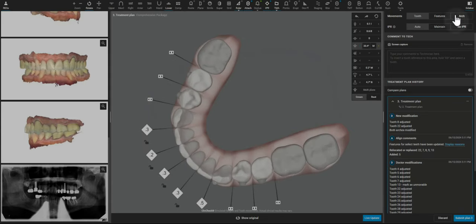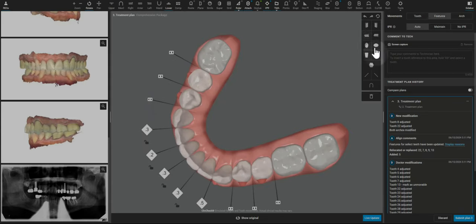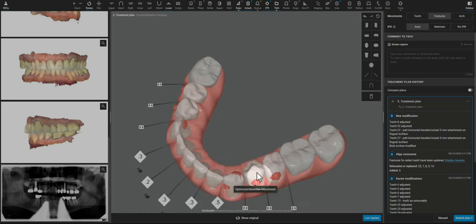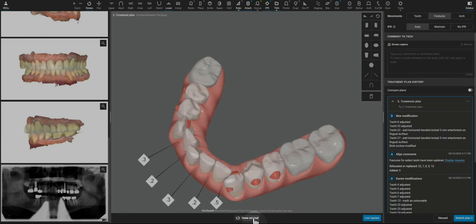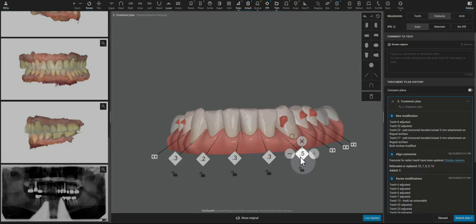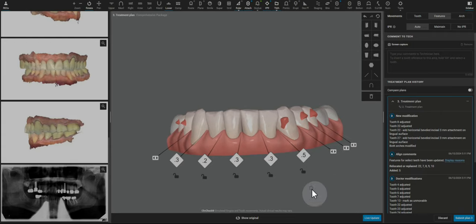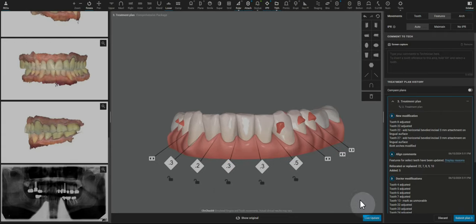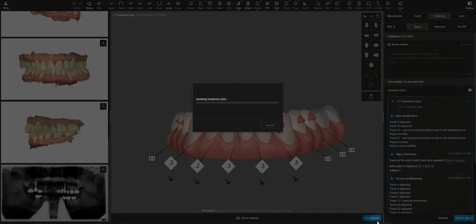And I'm going to add Dr. Galler's secret sauce of attachments for lower anterior intrusion. And we are ready to rock and roll with this ClinCheck. Thanks so much.